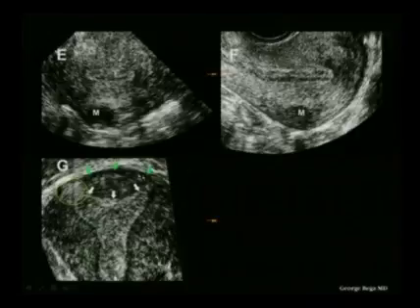Here we have the external contour of the uterus, and this is the shape of the endometrial canal. Very useful in ruling out and differentiating between bicornuate versus septate versus arcuate uteruses. And this is really the only way to do it. In 2D ultrasound, we cannot reliably differentiate between these entities.